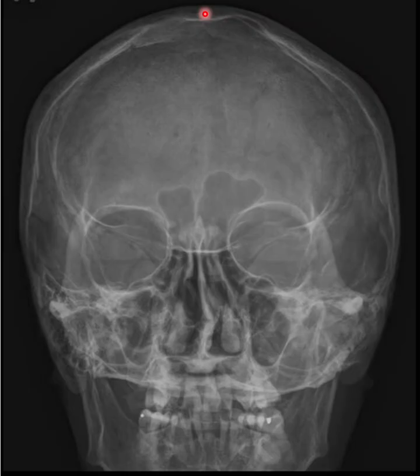Now the Caldwell skull is for the frontal bone, and that is right here in the center of the image, the frontal bone. So in order to see the frontal bone, we ask the patient to flex their neck and to place their forehead on the bucky or the IR. And then we will take the tube and we will angle 15 degrees caudal, entering posteriorly and exiting the nasion, where the bridge of the nose is, anteriorly on the face.